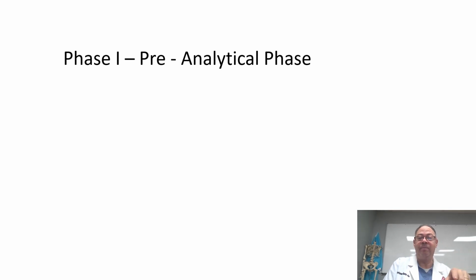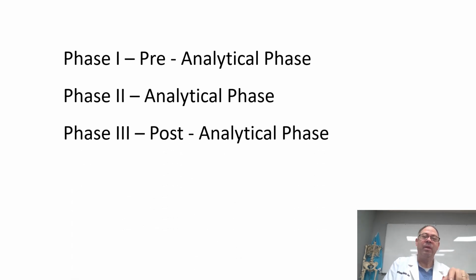Look where the problem is. Let's put it quickly. In the pre-analytical phase, we have errors.